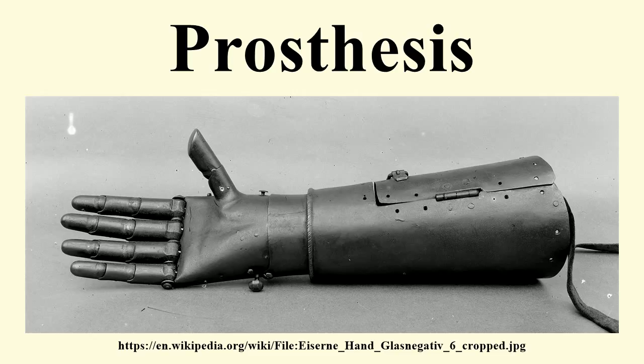Blatchford released another prosthesis, the Adaptive Prosthesis, in 1998. The Adaptive Prosthesis utilized hydraulic controls, pneumatic controls, and a microprocessor to provide the amputee with a gait that was more responsive to changes in walking speed. Cost analysis reveals that a sophisticated above-knee prosthesis will be about $1 million in 45 years, given only annual cost of living adjustments.